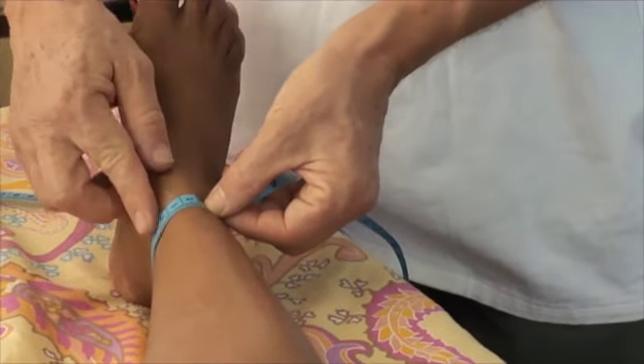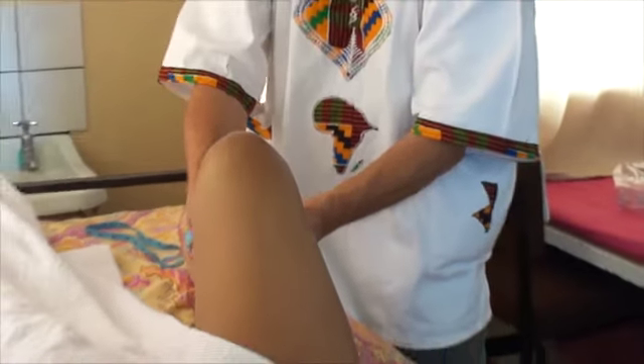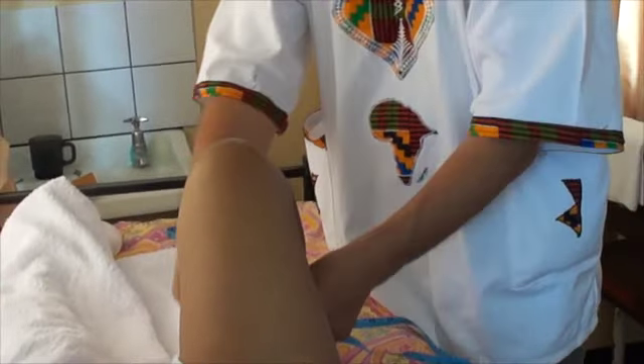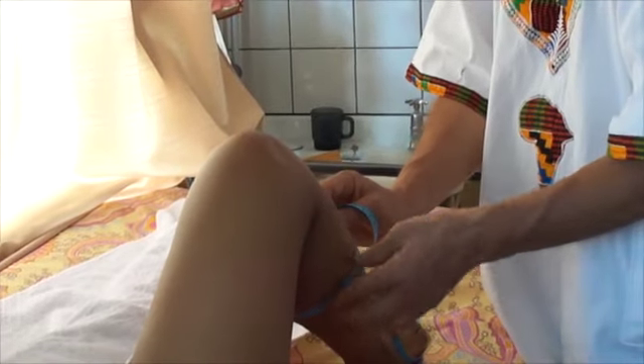You have the malleoli just above. Then you can take a 90-degree position to locate where is the biggest part of the lower limb. And there where you can feel the largest circumference, there you measure it. Just put it where the biggest circumference is, and there you measure it.